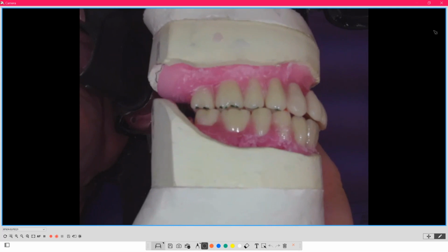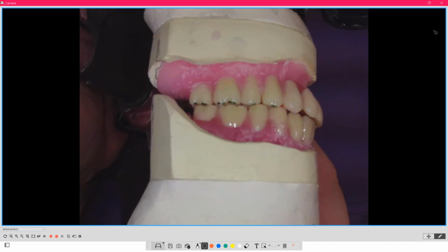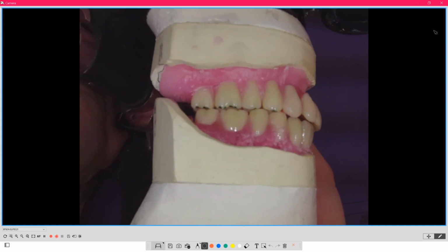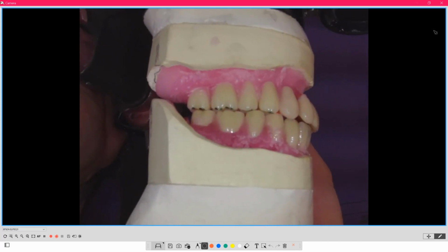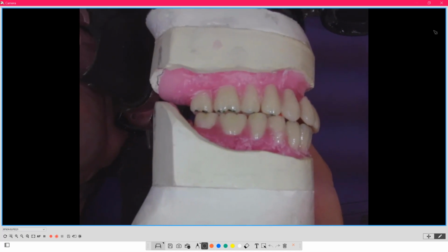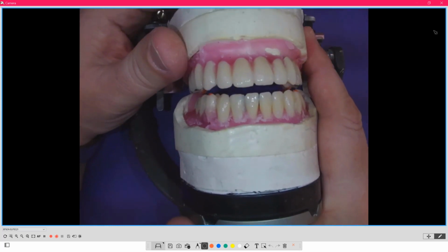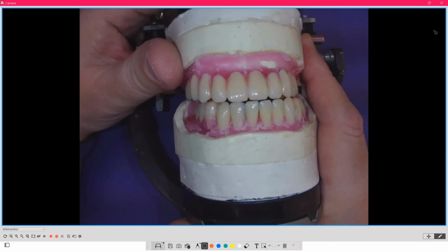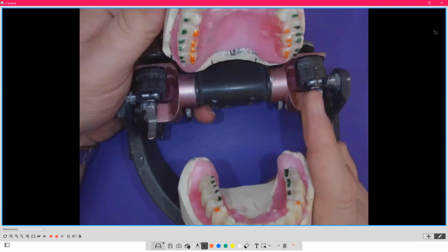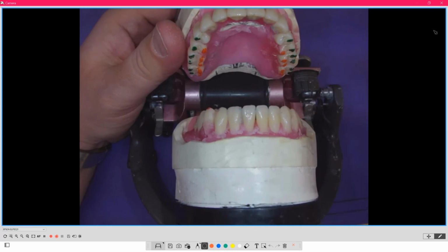Why? So the food stays on the bowl to get crushed. It doesn't get pushed off. When it's knuckle tight, the food gets pushed off. That's milling. This isn't milling. That's not effective anymore. That theory isn't accurate anymore. You want a mortar and pestle crushing tooth. And then I can go through a chew cycle. So I know, oh, they swing out to their left. I have to pay attention and I function more and I move the articulator. Now, I can even do this on hinge articulators. You can move things. You just have to learn how.